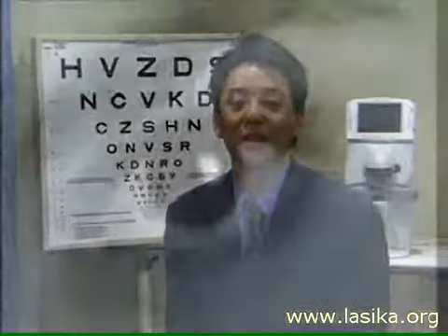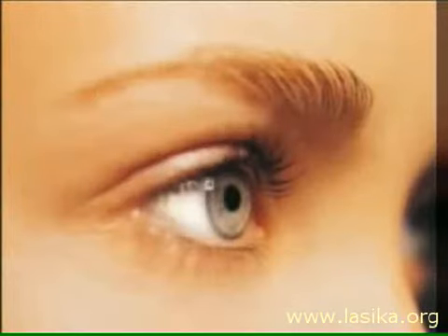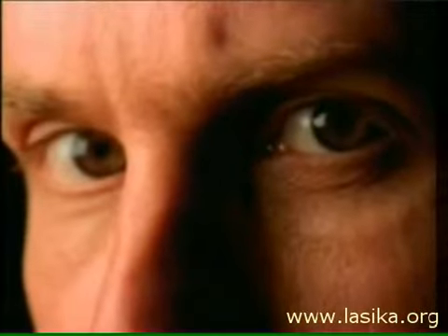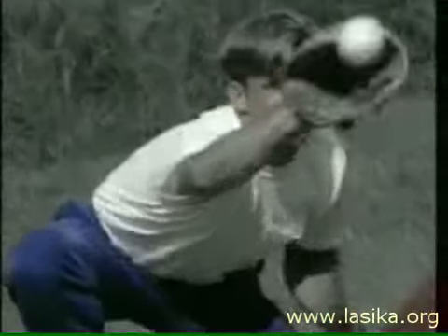By that same token, if you take 50 people that have the exact same eyeglasses prescription and you look at their eyes, you actually have 50 different eyes. Custom technology takes that into consideration, so you're actually getting a treatment that is custom made for you, where we take into consideration all the little individual differences between people, and that's the treatment that you get. As a result, the vision tends to be a little bit better and sharper.